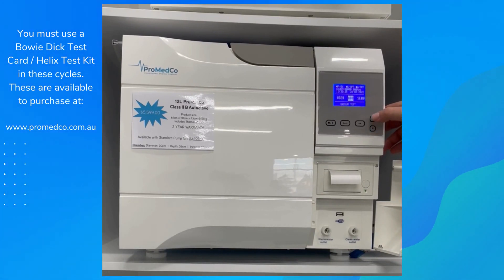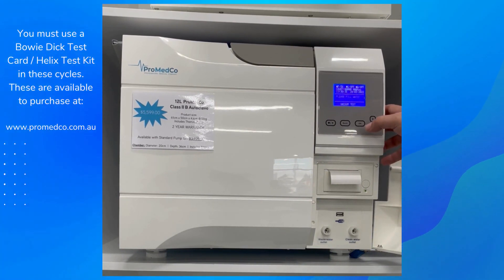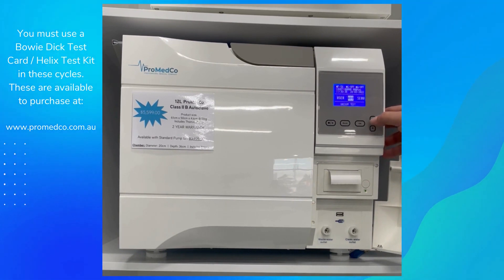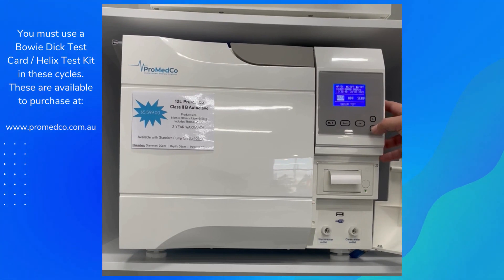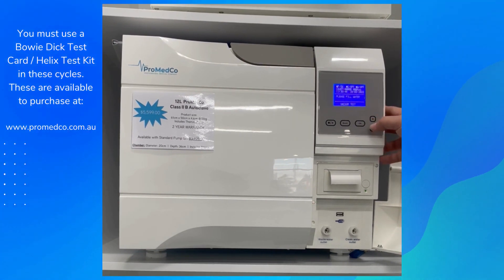After we run a vacuum, we want to run a Helix test or Bowie Dick test. Essentially this is running a PCD test to make sure the machine is actually doing what it's supposed to do. It's a requirement from European standards and Australian standards.